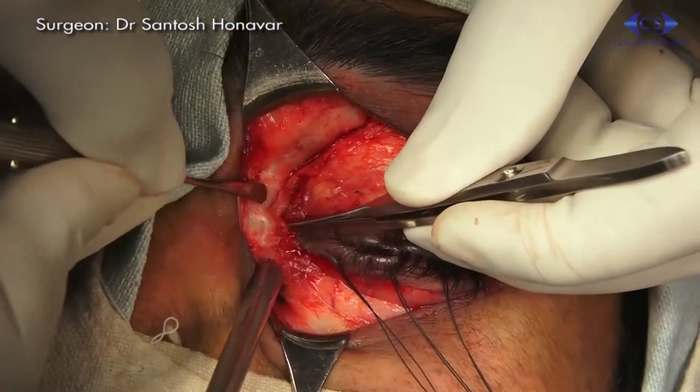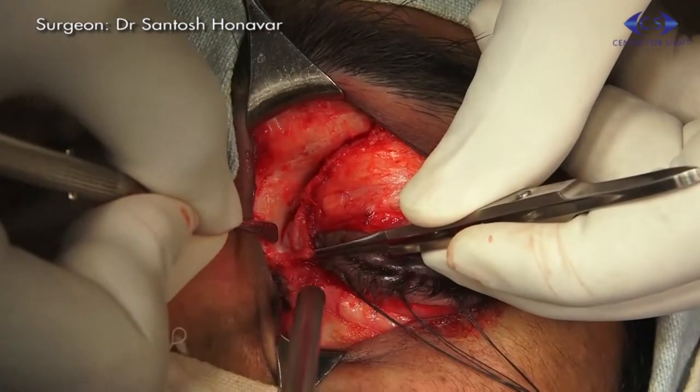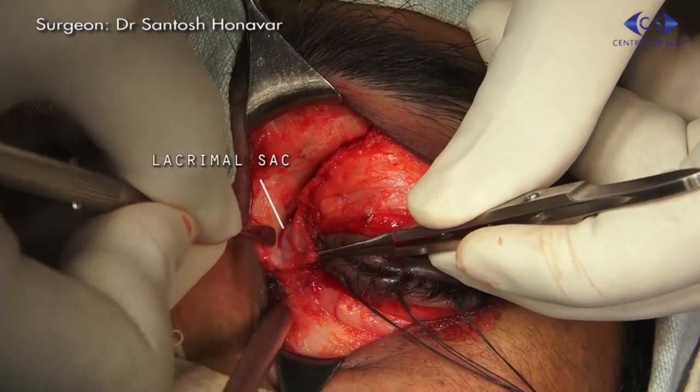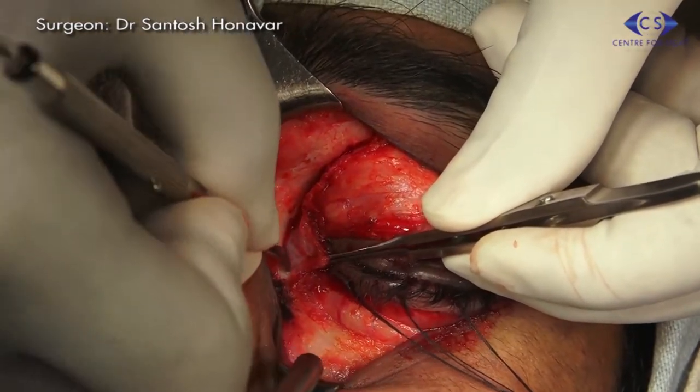Dissection should be performed carefully along the medial wall so as to not fracture the thin lamina papyracea.